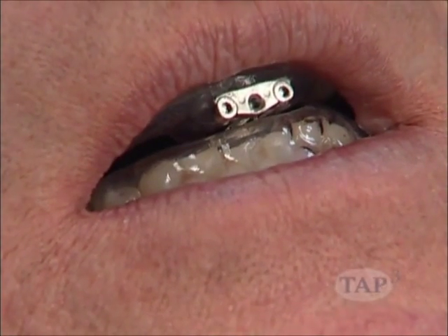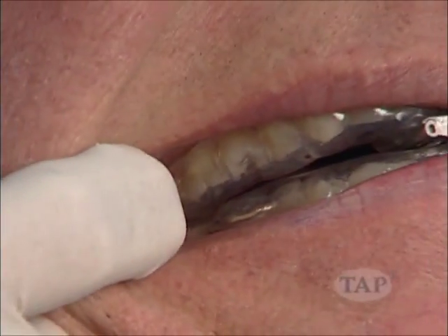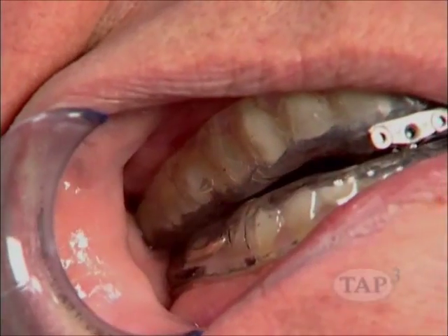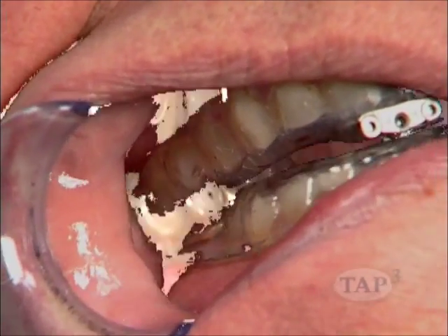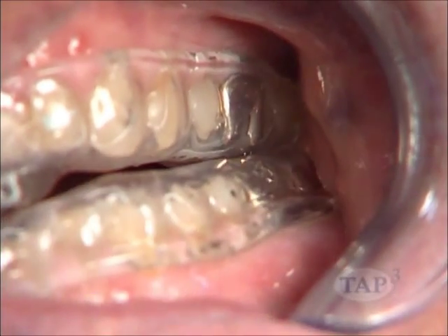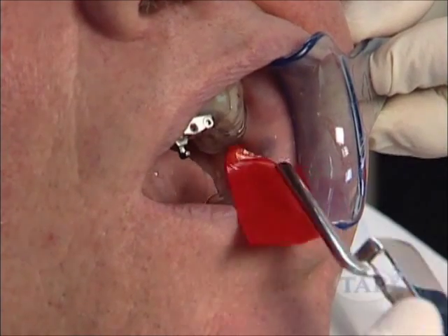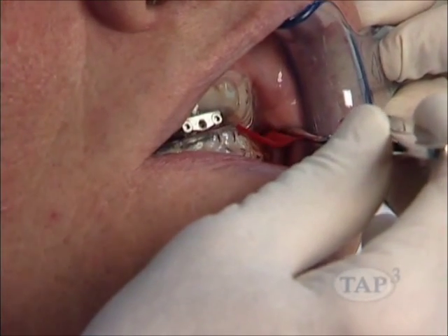After the hook is set, the next step is to clear any posterior interferences. If there is any posterior interference, such as imbalance in the trays, or if one side is higher than the other, it could cause TMJ problems. Mark each side of the tray with ribbon.